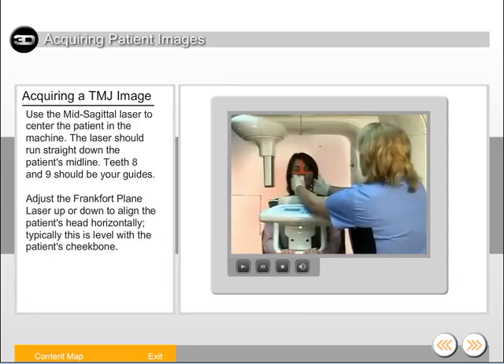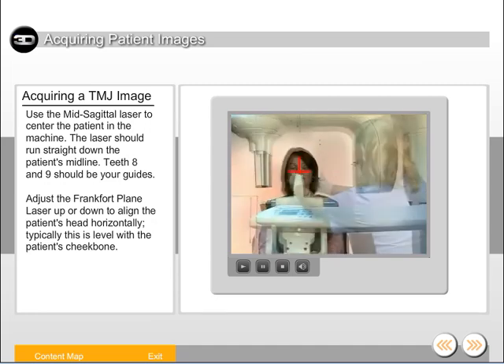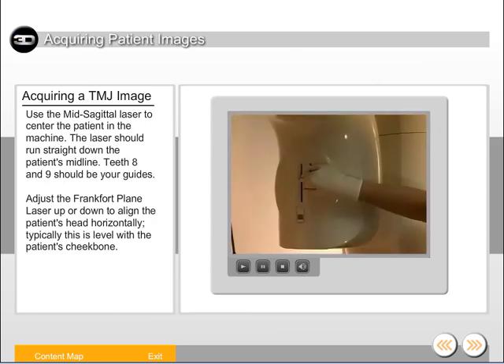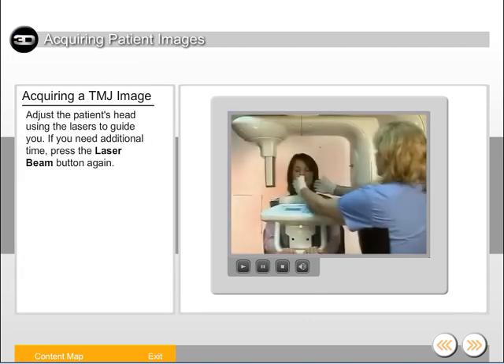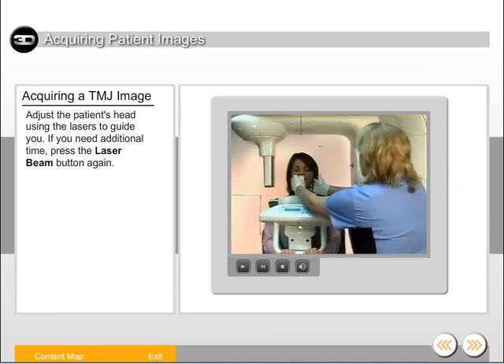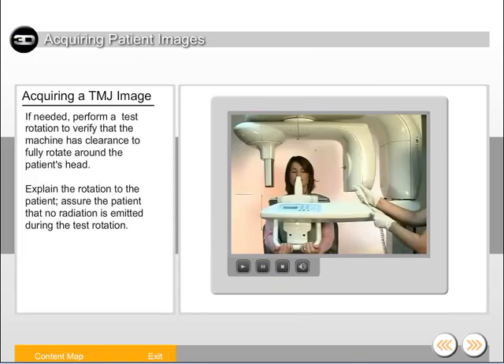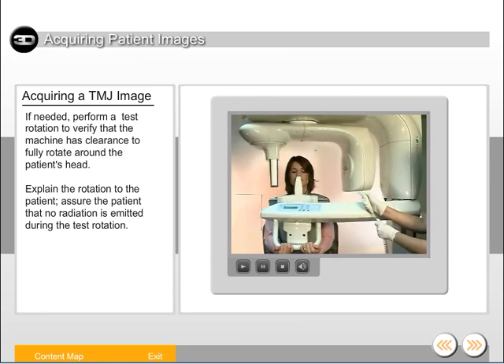Use the mid-sagittal laser to center the patient in the machine — the laser should run straight down the patient's midline. Teeth 8 and 9 should be your guides. Adjust the Frankfurt plane laser up or down to align the patient's head horizontally; typically this is level with the patient's cheekbone. Adjust the patient's head using the lasers to guide you. If you need additional time, press the laser beam button again. If needed, perform a test rotation to verify that the machine has clearance to fully rotate around the patient's head. Explain the rotation to the patient and assure them that no radiation is emitted during the test rotation.